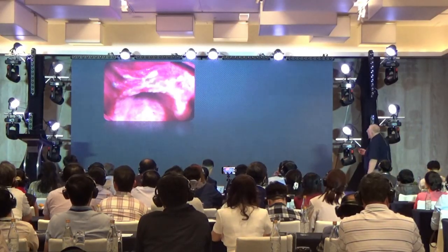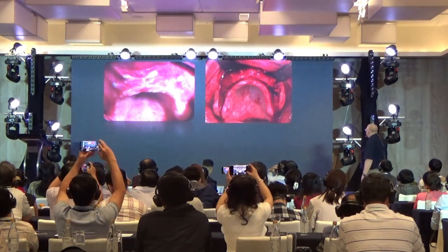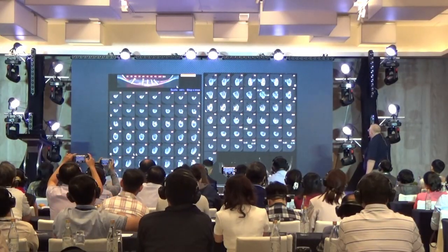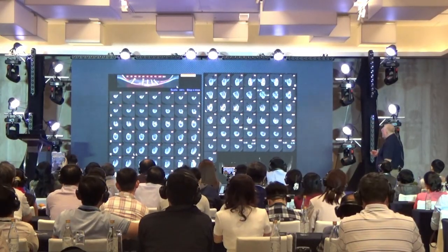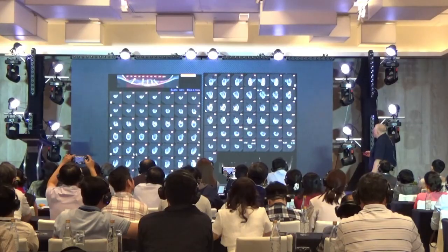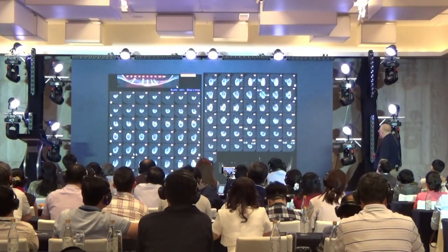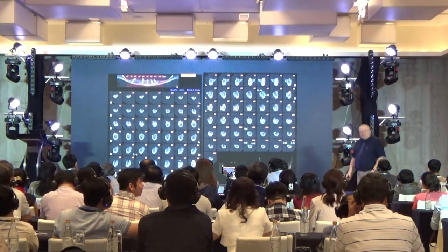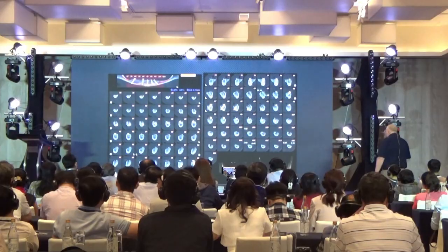And you can see here the screws, but again, we had enough bone. And you can see here the bone, and the lateralization of the nerve. And look here how close we were to the inferior border of the mandible.